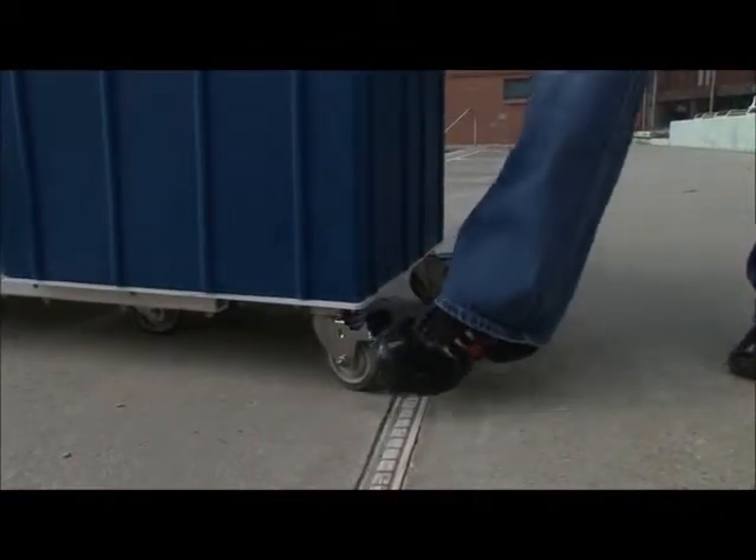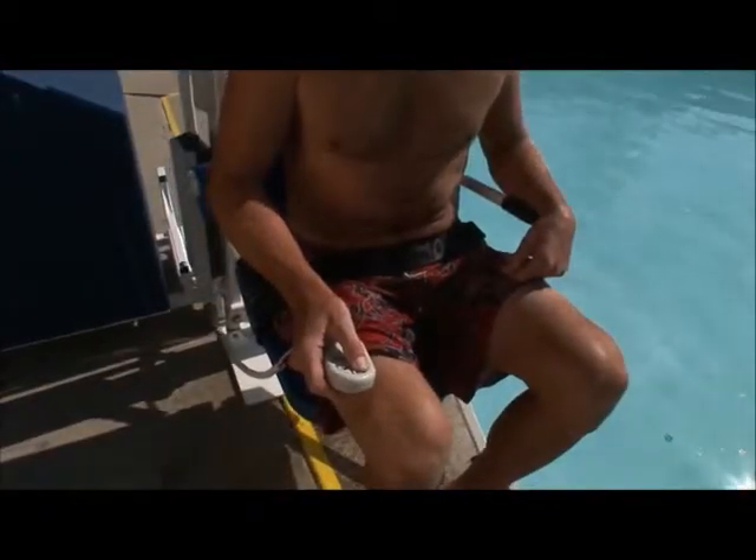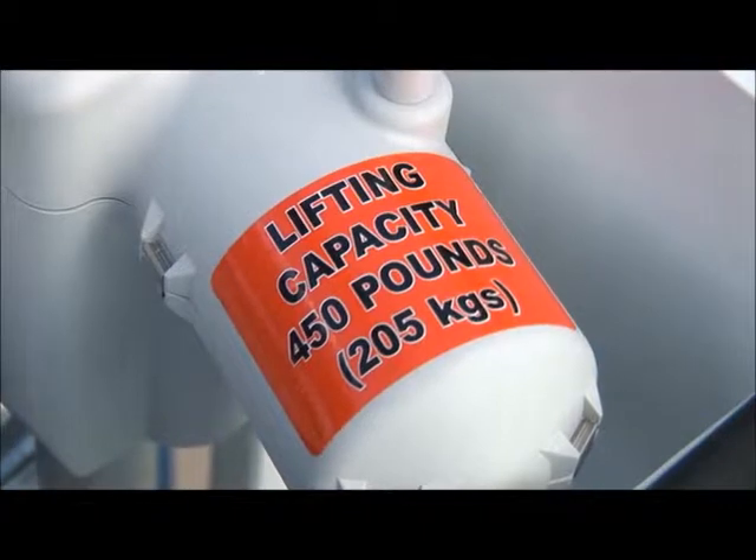The Patriot incorporates durable 3.5 inch stainless steel frame casters with rubber wheels and locking brakes. This portable lift has a capacity of 450 pounds.